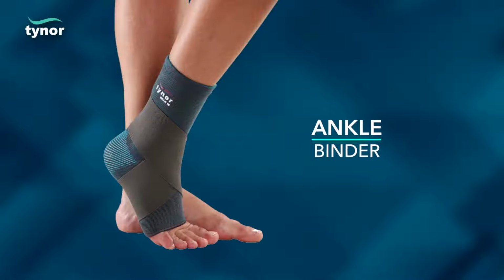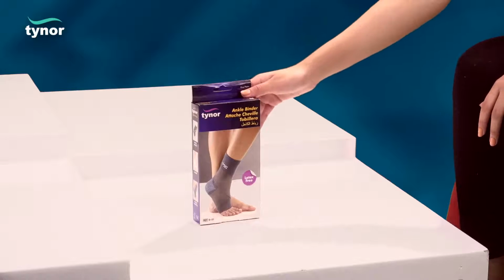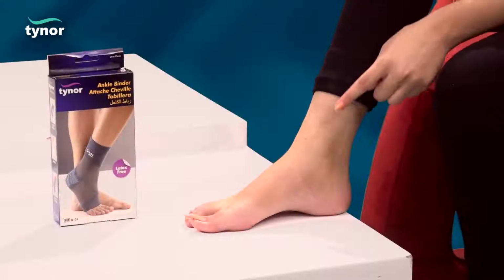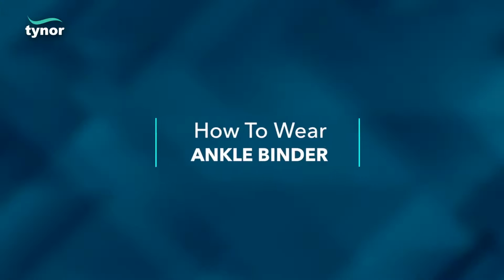Here, we will discuss how to measure the size and how to wear the ankle binder. The ankle binder is available in 4 sizes. Measure circumference approximately 2 inches above the inner ankle joint. Now, let us see how to wear the ankle binder.